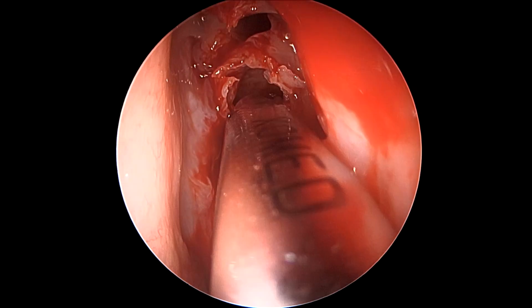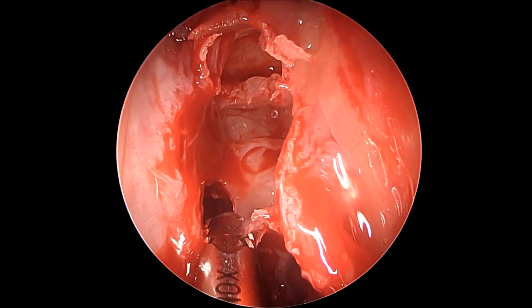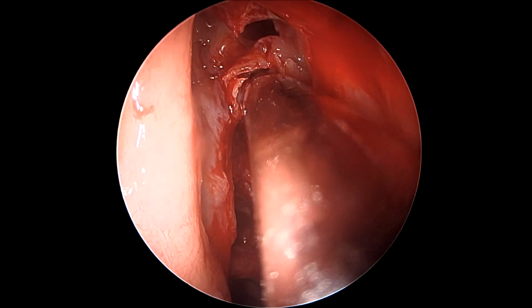Once we open the sphenoid, we know what is the lowest level of skull base, and from therein we start the more and more septation of the ethmoidal cavity from posterior to anterior, and that's obviously a safer way because we go from the lowest part of skull base substantially each time higher.